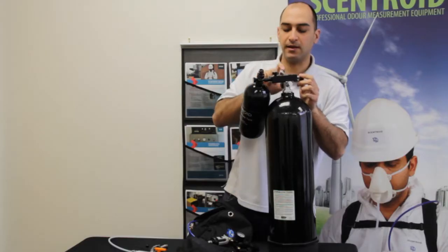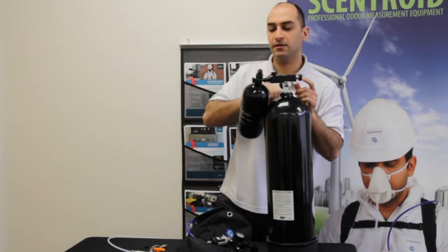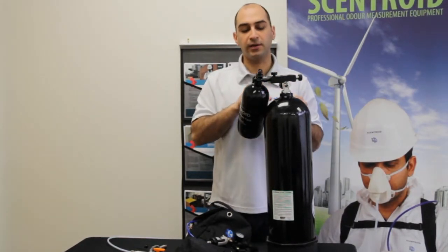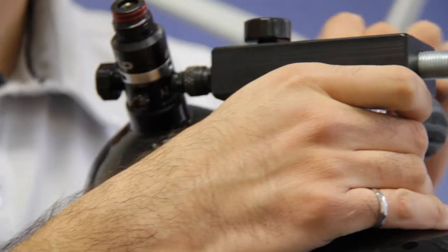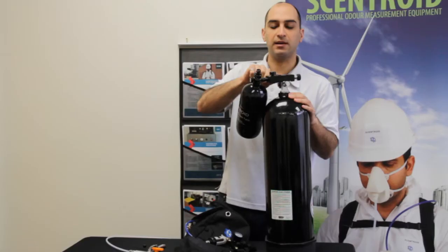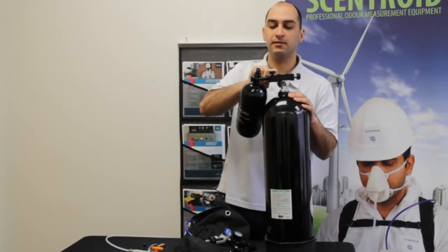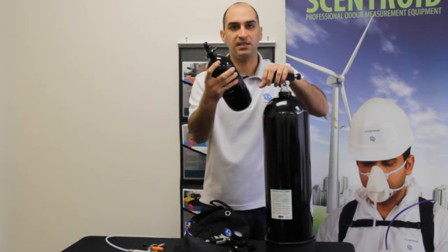Now we just turn on the air and you wait. When you hear that the air is going in and it stops, that's when it's full. We close the valve and vent the air that's trapped between the two tanks. That simple.